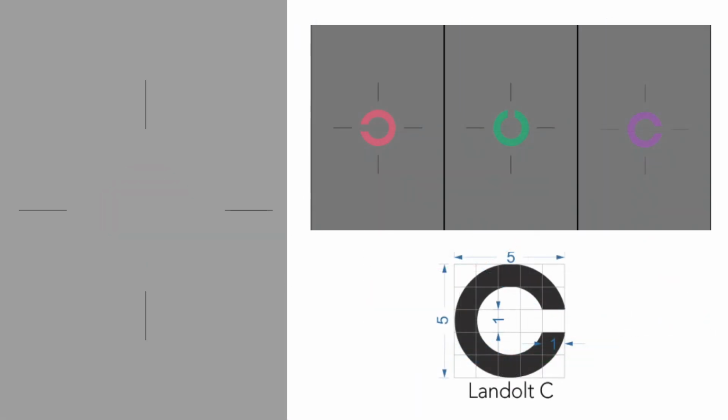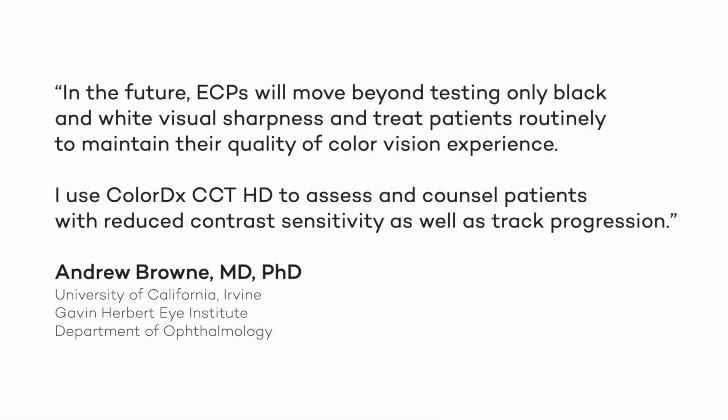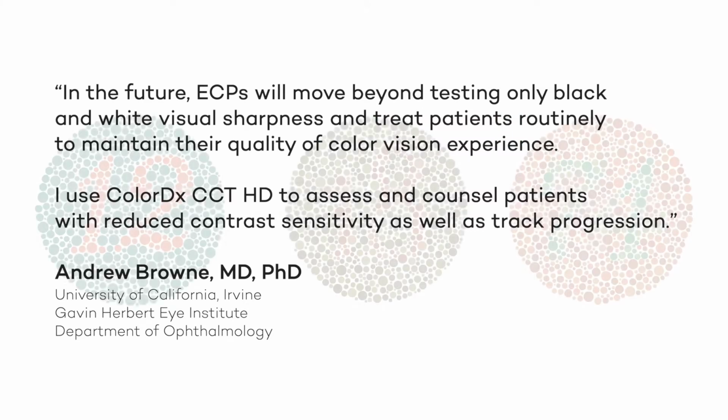The patient is required to respond to different contrast levels of 3 cone-specific Landolt-C targets. Persons with the ability to distinguish low contrast levels for each of these targets have normal/typical color vision. Contemporary eye care includes qualitative and quantitative assessment of functional color vision.